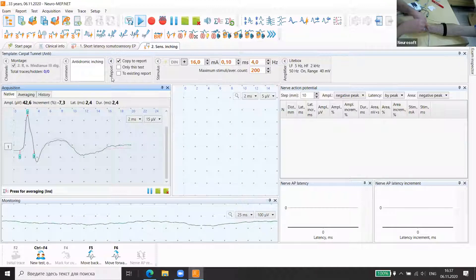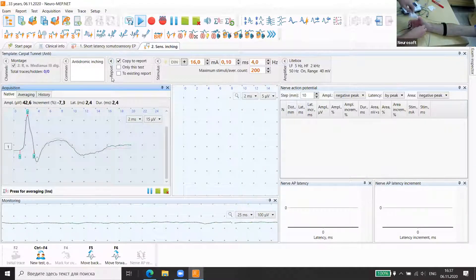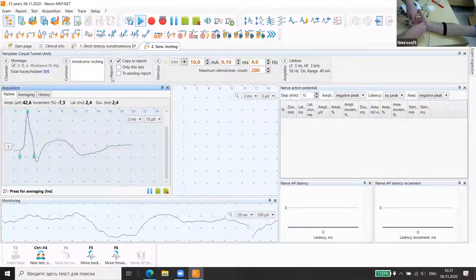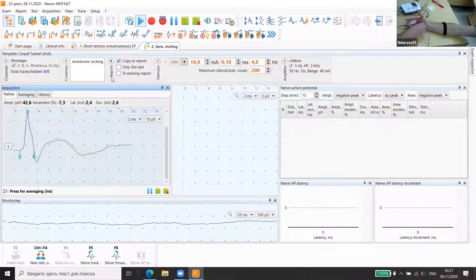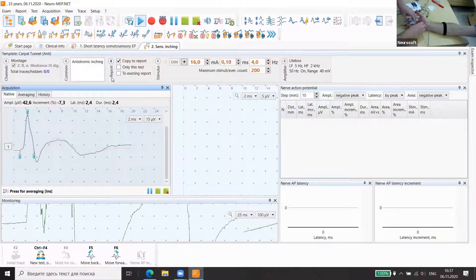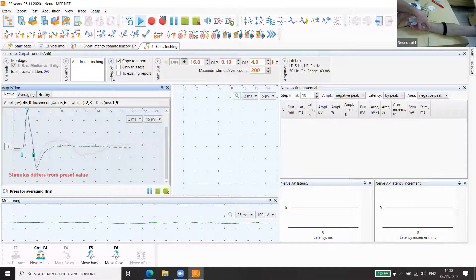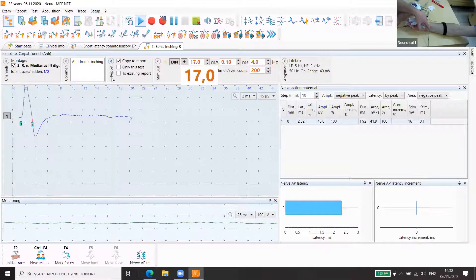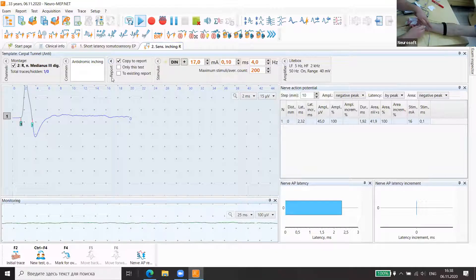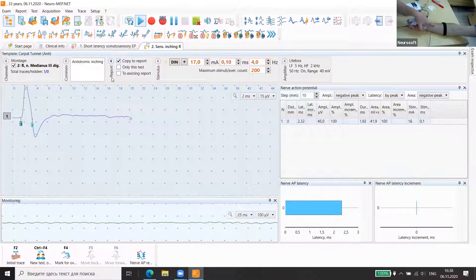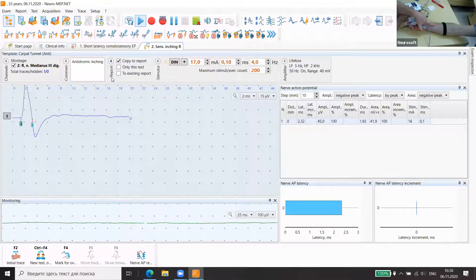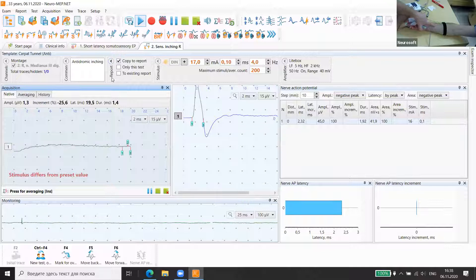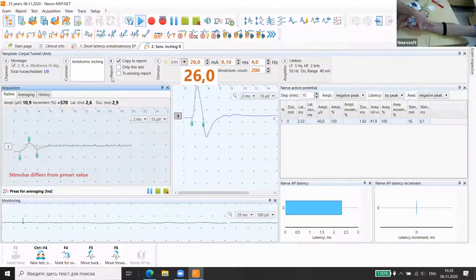We also can add some gauze between fingers. It sometimes decreases the stimulation artifacts. Yes, some better. Good answer. The first point. Now we change the position one centimeter. Sometimes we can use two centimeter distance.